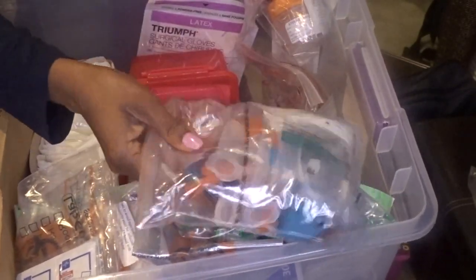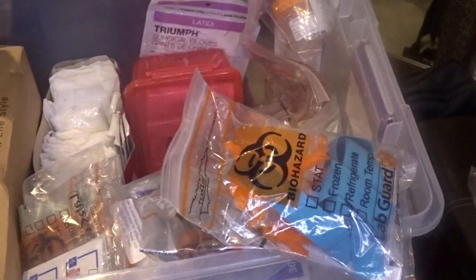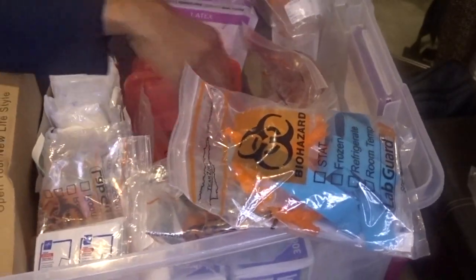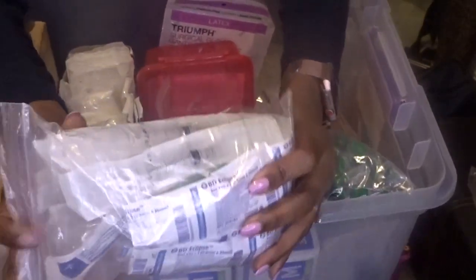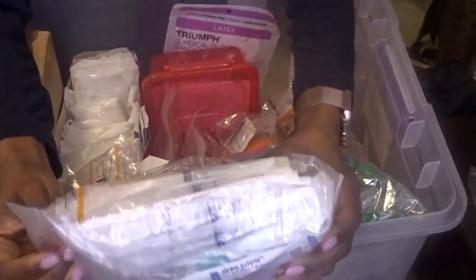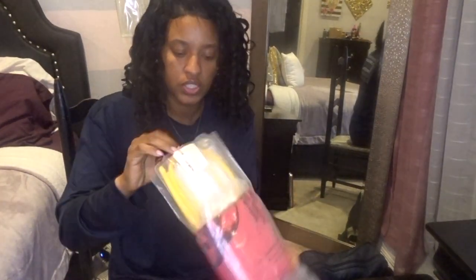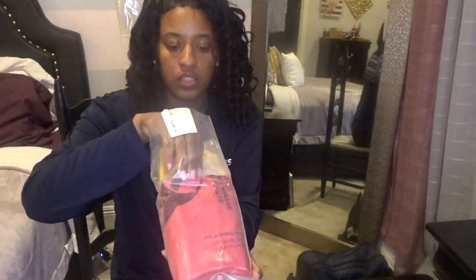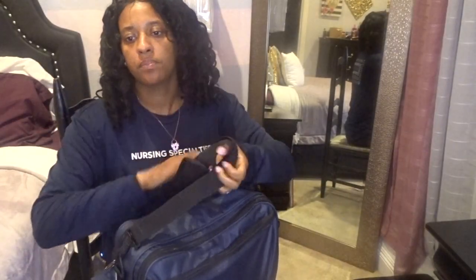I also have more vacutainers and extra needles, urinary collection cups, 60cc syringes, and syringes and needles for injections in different sizes. This is my MRSA kit, which includes a disposable stethoscope and a disposable blood pressure cuff — just like the one you see in the hospital. And finally, a blood spill kit. That's about it.